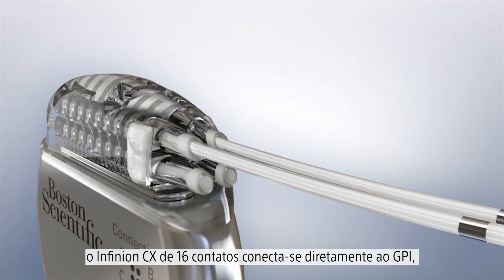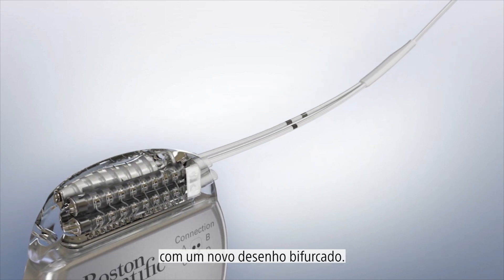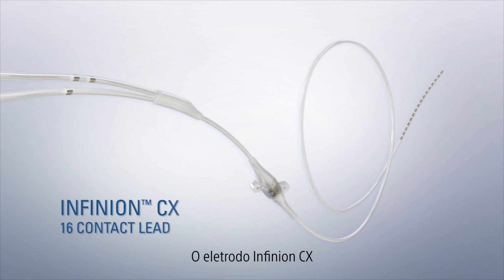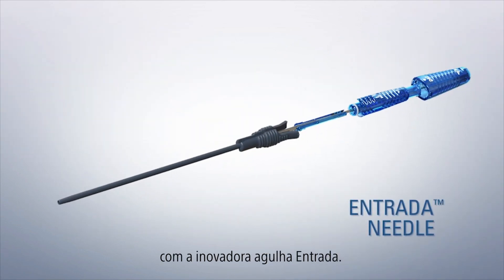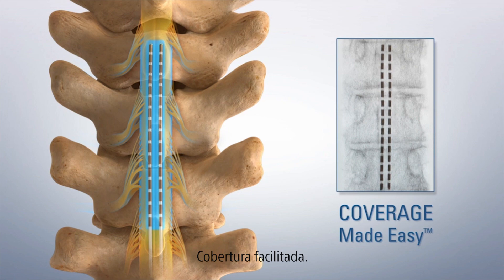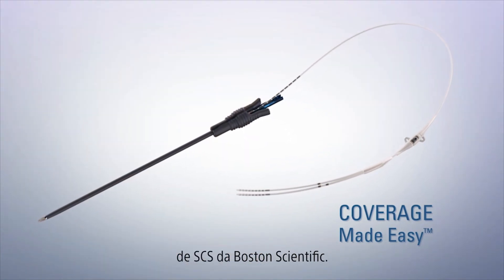The 16-contact Infinion CX connects directly into the IPG with a new bifurcated design. The Infinion CX lead with the innovative Entrada needle. Coverage made easy. Exclusively for Boston Scientific SCS Systems.